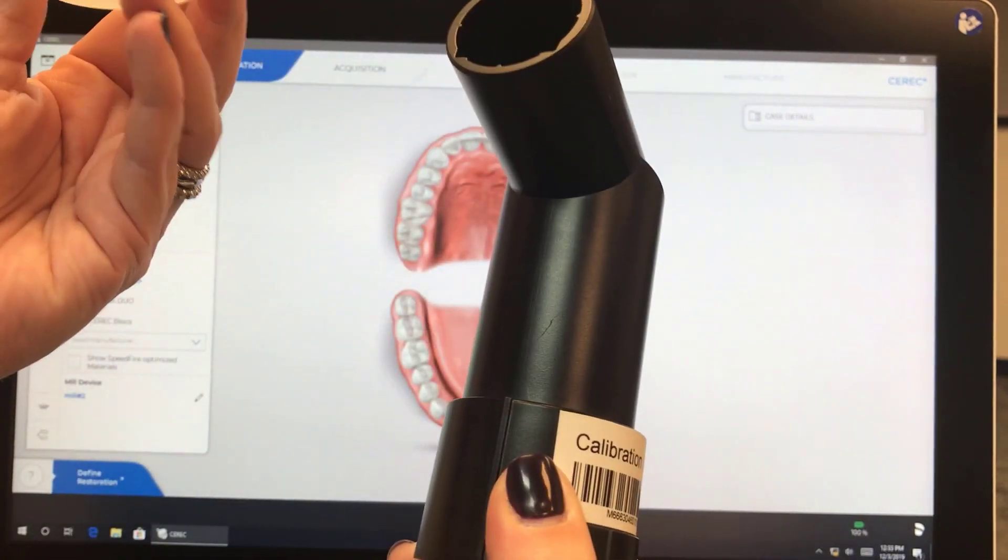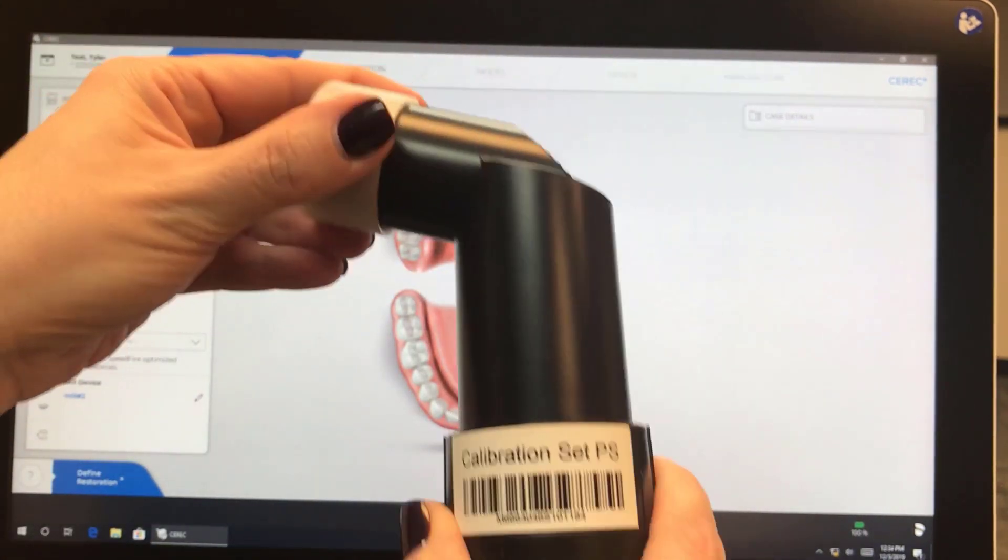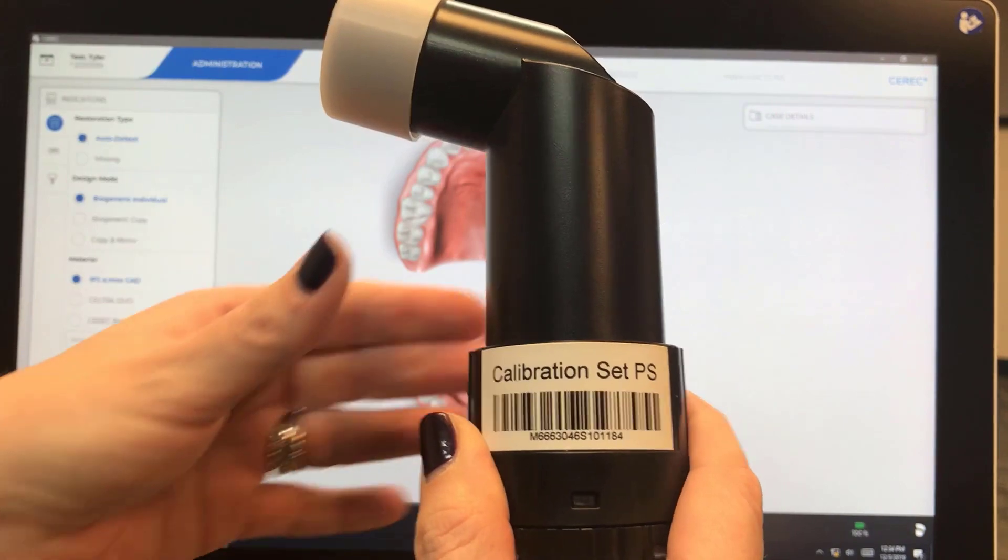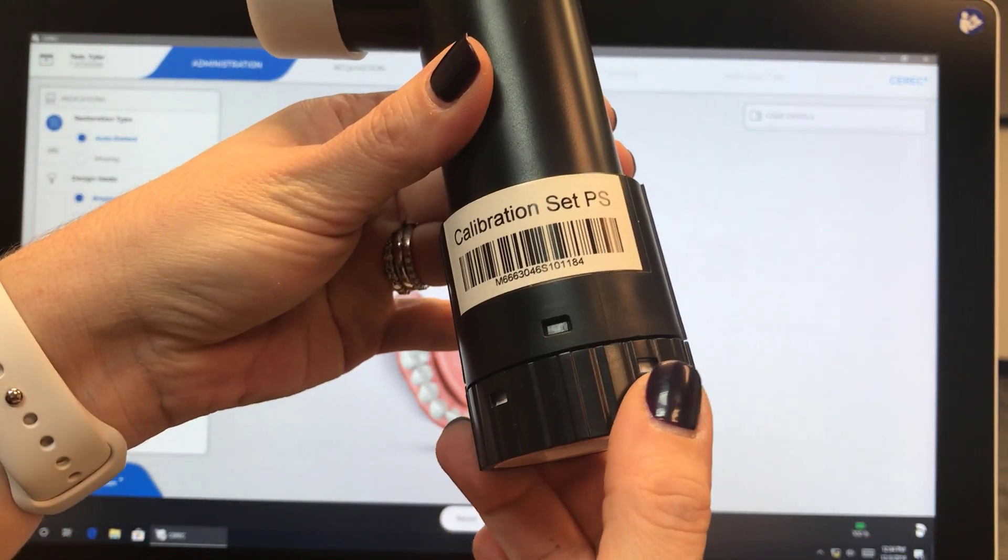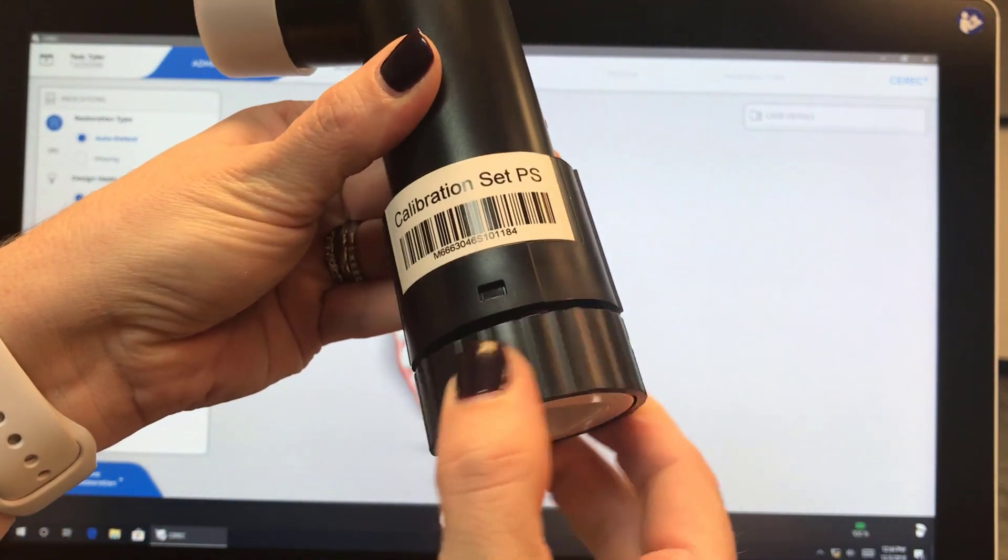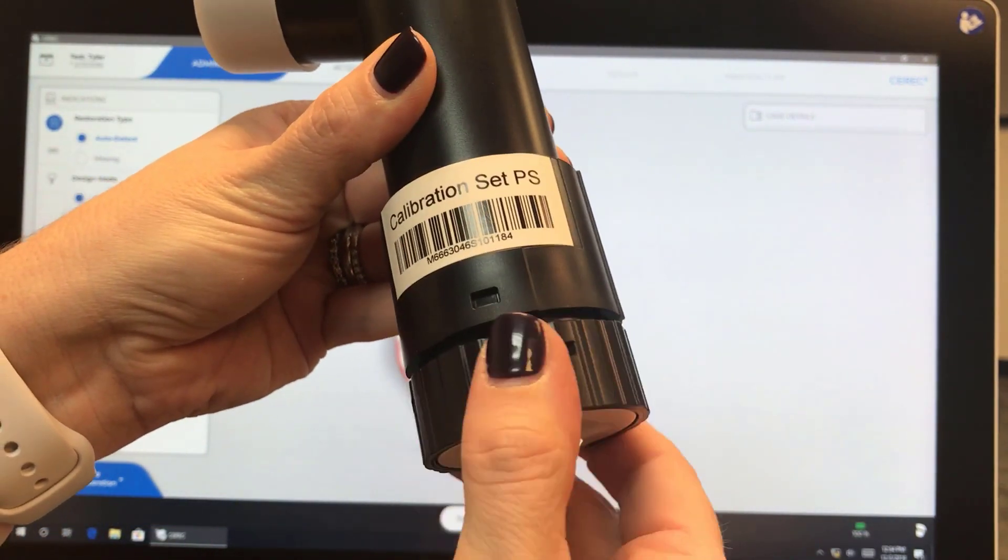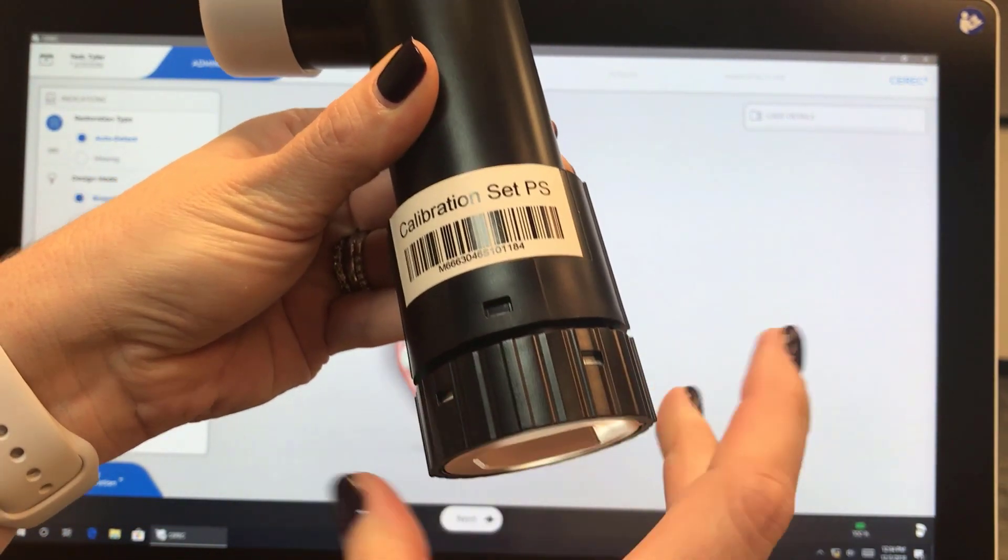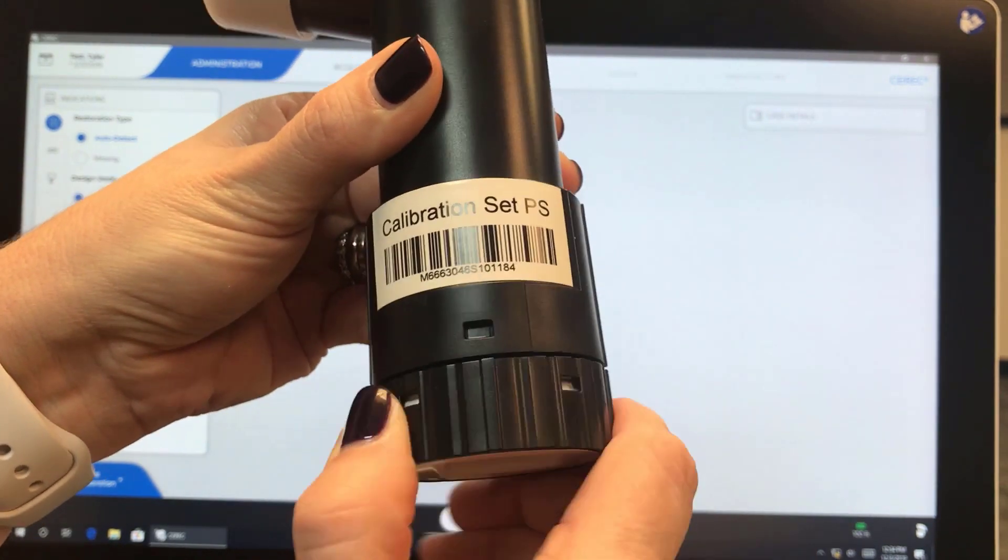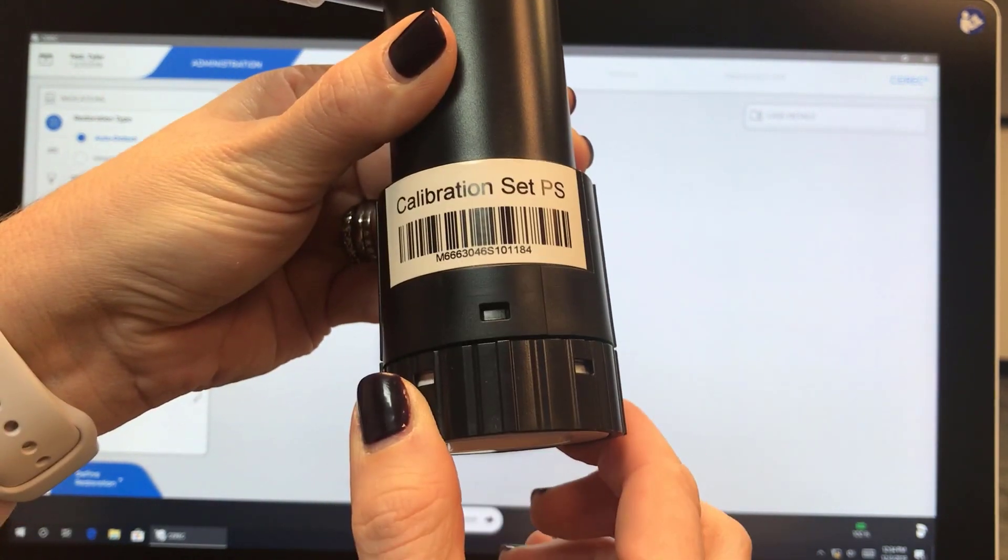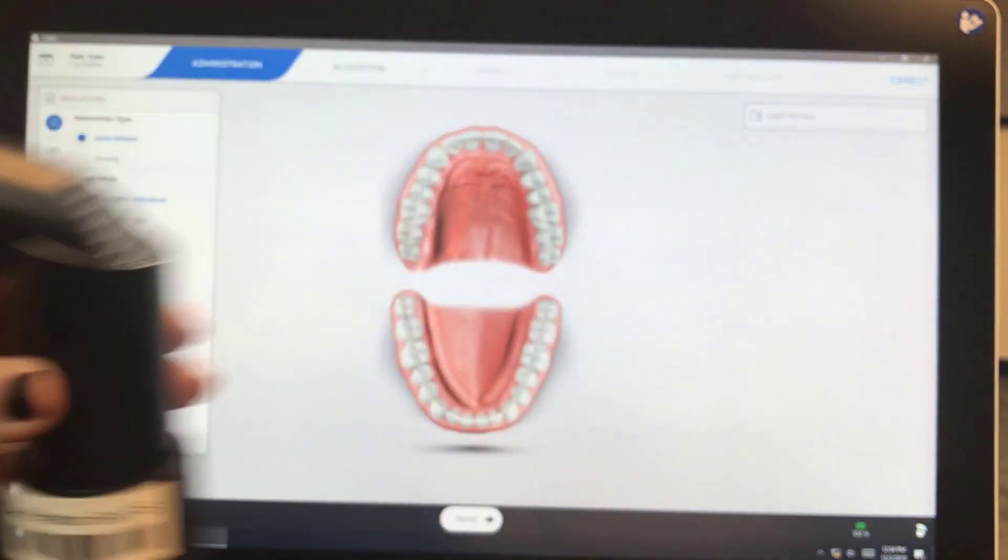This is just a dust cover. You want to keep it on at all times when not in use. And as we calibrate, we're going to unscrew the bottom. So before we start, we just want to make sure that we screw the bottom all the way in.